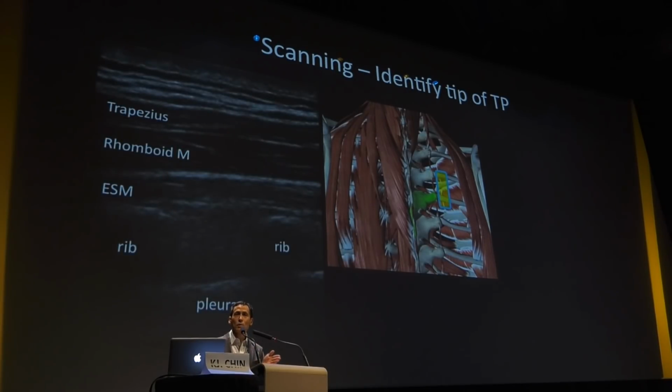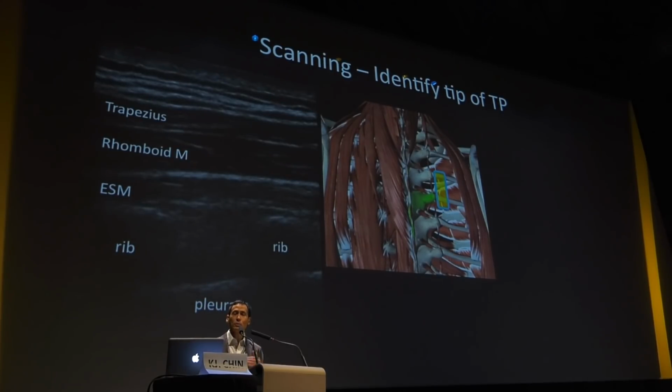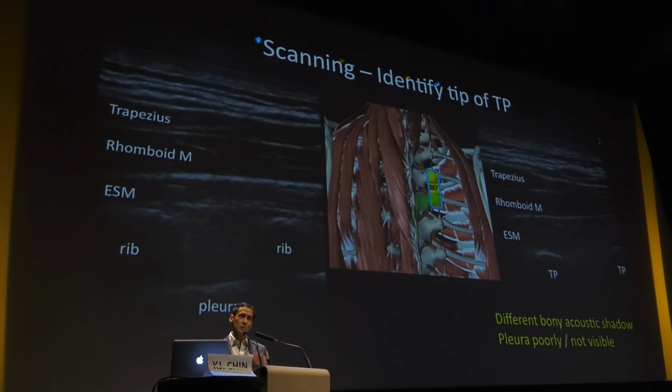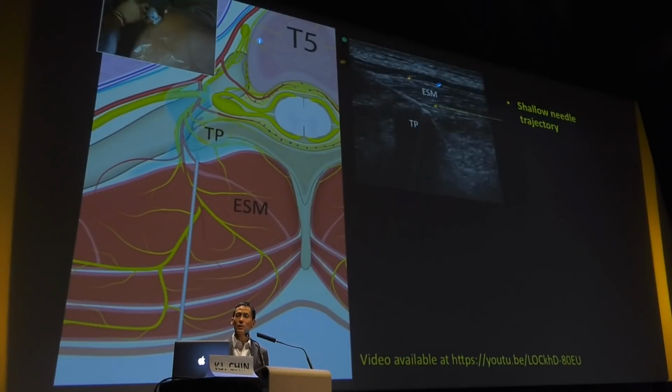And the classic approach that we recommend nowadays is to turn your probe into a parasagittal orientation. And if you're a little bit lateral, you will be over the ribs, which you'll recognize as these rounded shadows with a pleural shadow below that. And if you move yourself in a little bit more medially, the shadow will change to something more squared off and you will lose sight of the pleura, which is curving away from you. And that is the tip of the transverse process. And that's what we want to aim for.